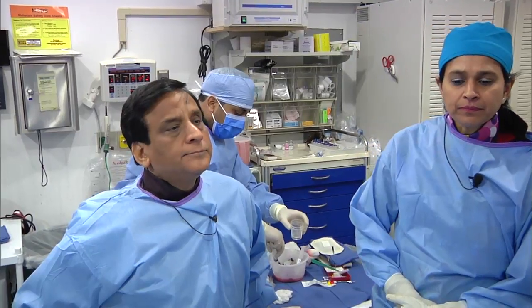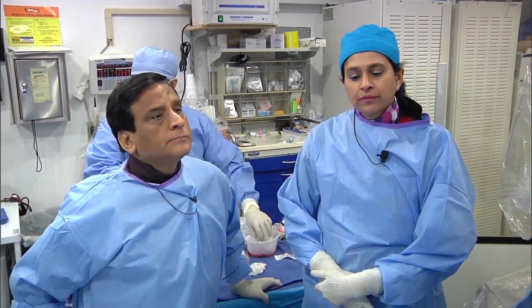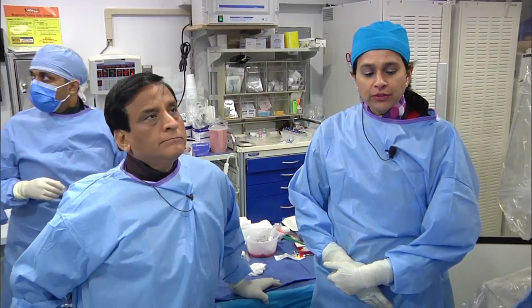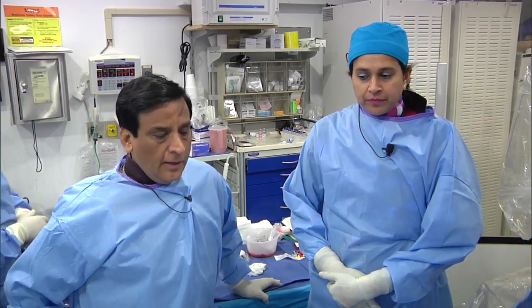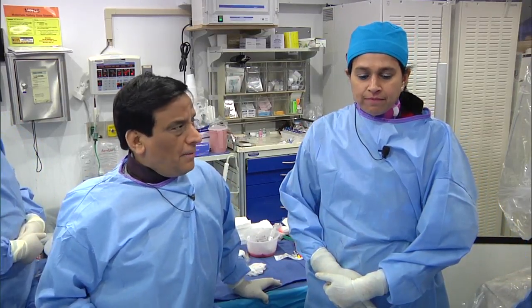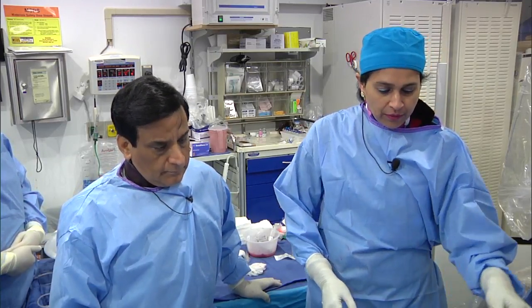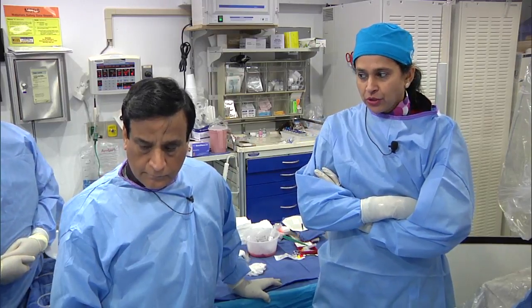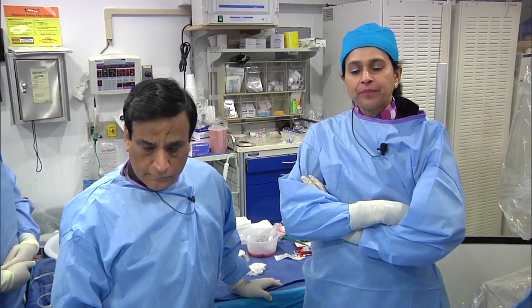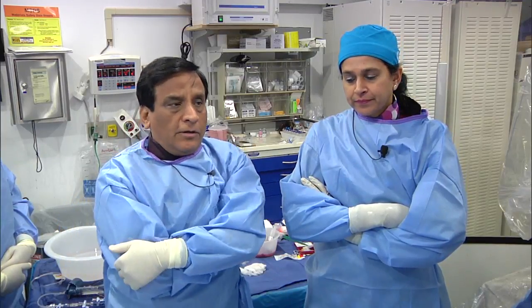Plus, whenever you're using a 2-stent strategy, a 7 French system would be ideal. Some of them are done with a reverse crush using one side balloon, but they're too complex. The reverse crush is when you wanted to do a single stent strategy, and then you wanted to stent the side branch after PTCA.